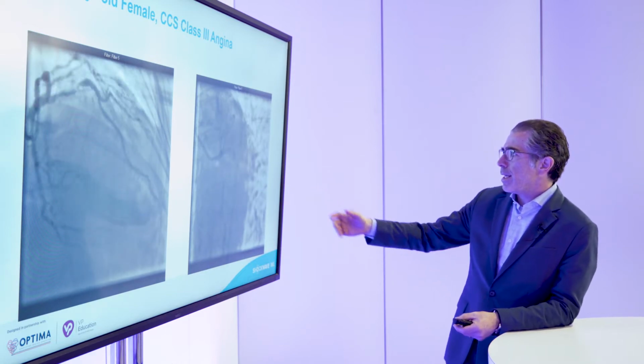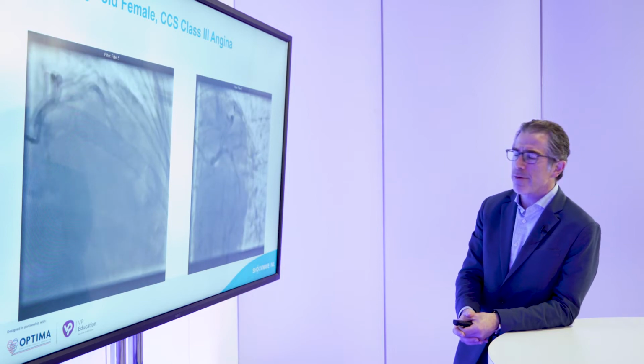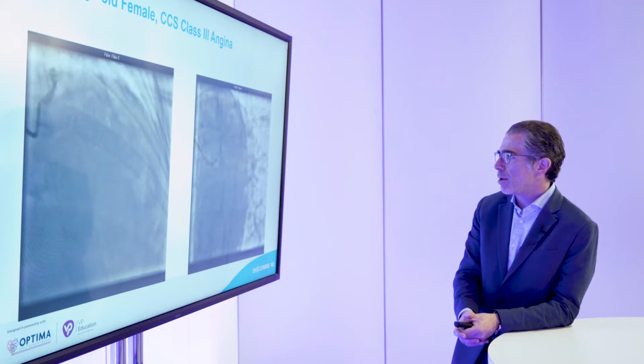And in the caudal projection, you see a highly calcified bifurcation lesion involving the first OM and the ongoing circumflex. So we focus on the LAD lesion alone. That would be a type of lesion that would have been enrolled in the Disrupt CAD III trial, although it is pretty complicated, but it does fit that criteria. On the longer aspect, it would be a longer lesion in that trial.